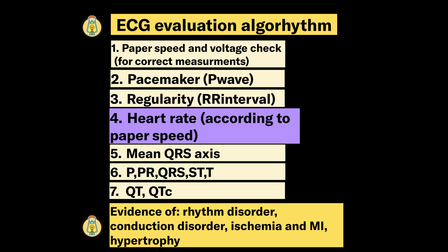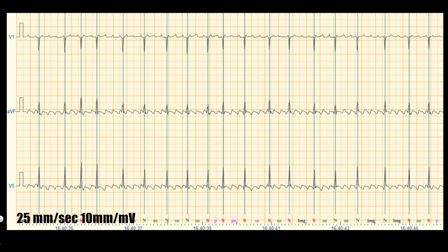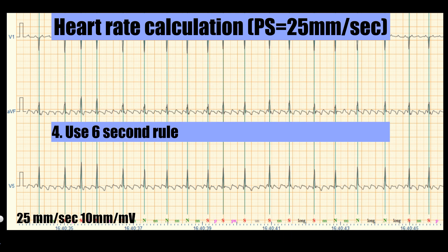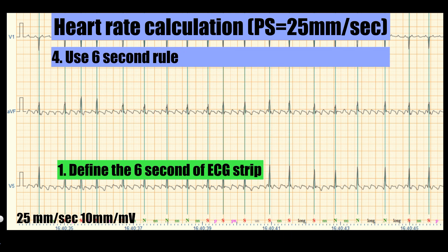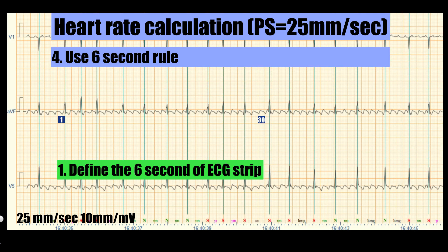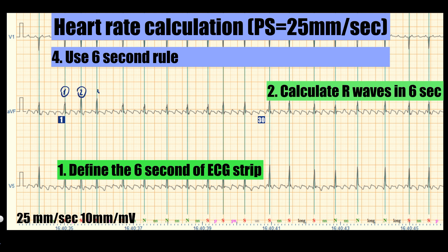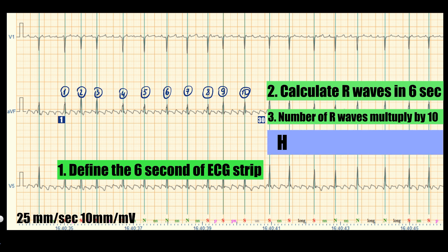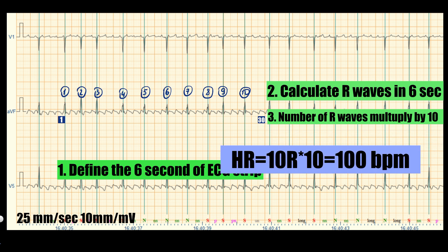Now let's calculate the heart rate. For heart rate calculation you can use any formula depending on paper speed. Using the 6-second rule, define 6 seconds on the ECG strip — at 25 mm per second, this equals 30 large boxes. Count the number of R waves inside those 30 large boxes, then multiply by 10. The heart rate here is 100 beats per minute.